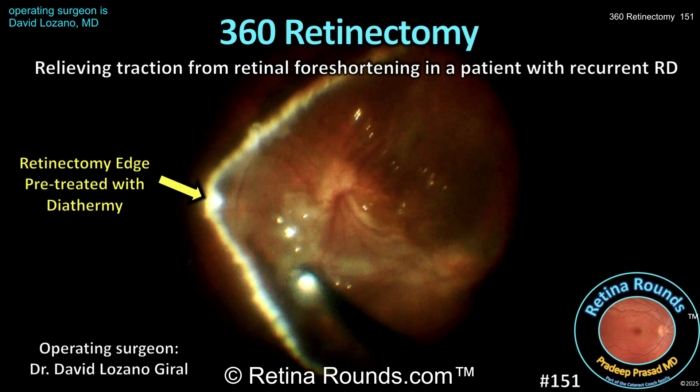Retina Rounds, episode number 151. Sometimes a 360-degree retinectomy is necessary to address vitreous base traction, retinal foreshortening, and to successfully reattach the retina. Often a retinectomy is necessary in the setting of advanced proliferative vitreoretinopathy. In today's video presented by guest surgeon of the week, Dr. David Lozano, we'll show you the surgical considerations and steps to perform a 360-degree peripheral retinectomy. We want to thank Dr. Lozano for sharing this case.